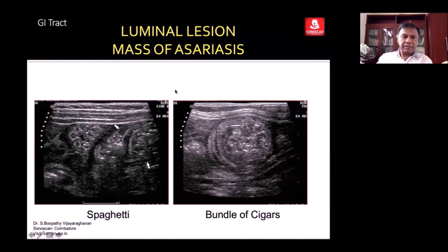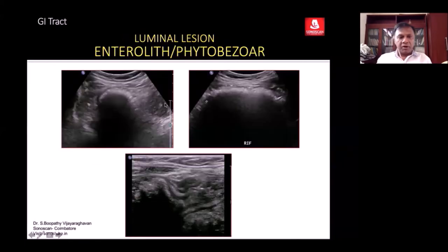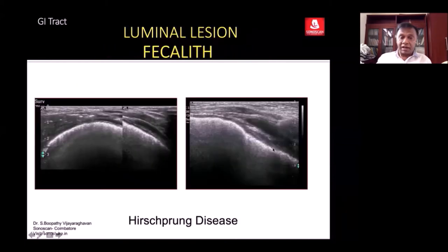It can be a mass of ascariasis, particularly in children presenting with acute colic. You see a mass where gas outlines the mass all around except one area, meaning it is within the lumen with a pedicle. On color Doppler you see flow. In a patient with pain abdomen, vomiting, and bowel obstruction, dilated bowel loops are seen. On tracing the dilated loop, you end up at a large echogenic mass with shadowing.